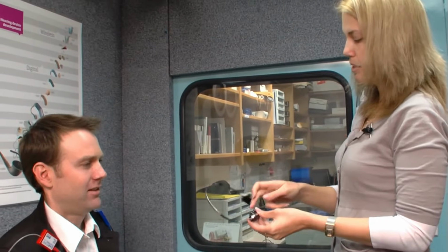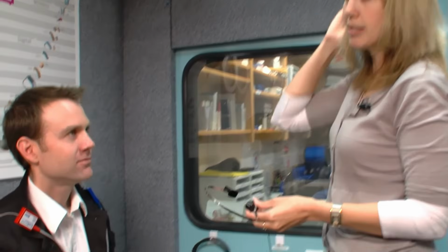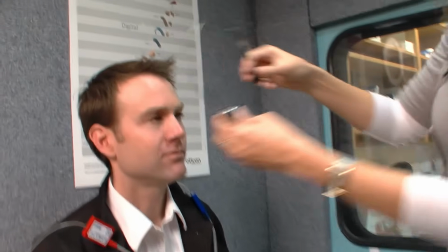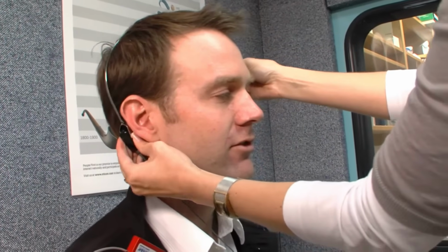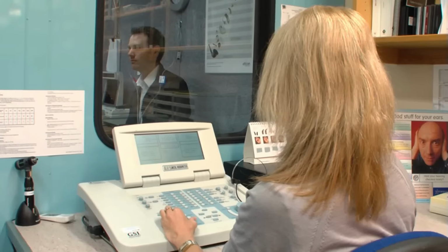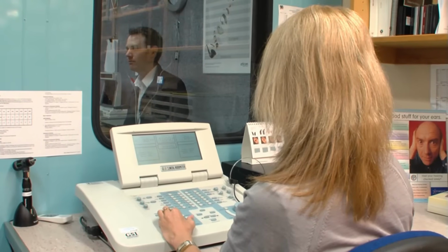All right, you're doing well so far. What we're going to do this time is put this headband on, and this little box just sits on the bone behind your ear. So all you need to keep doing is exactly what you have been doing. So just pressing that button whenever you hear the beep. Sure. This time you could hear it in either ear. Right. In the case shown here, the site of lesion is found to be the cochlea itself, rather than the middle or outer ear.